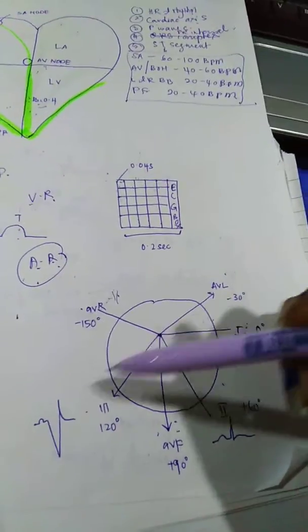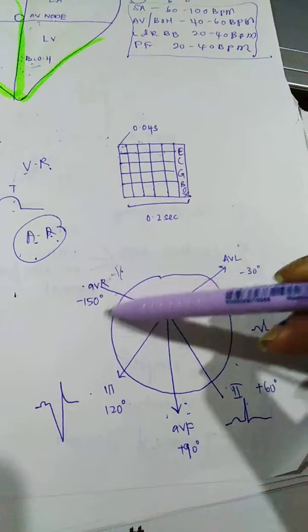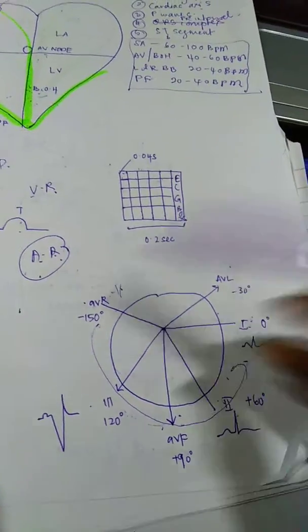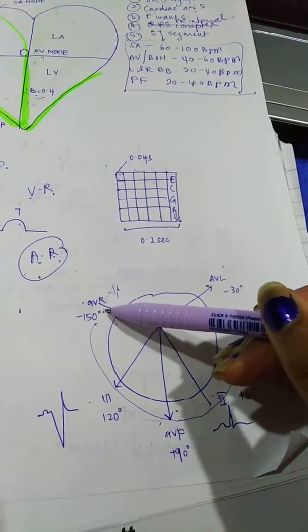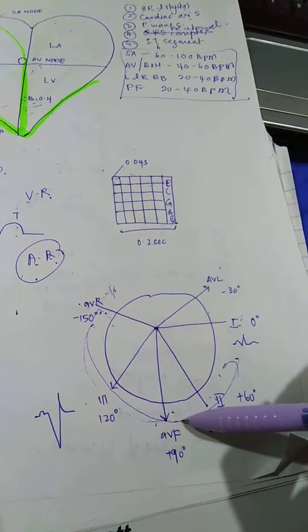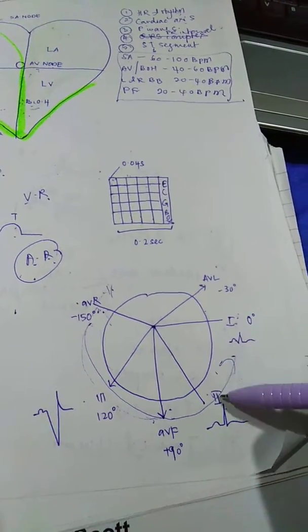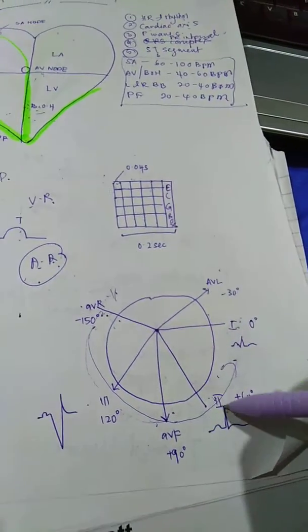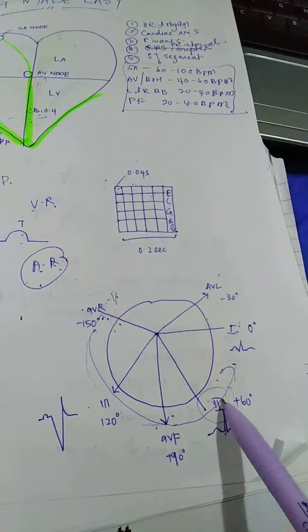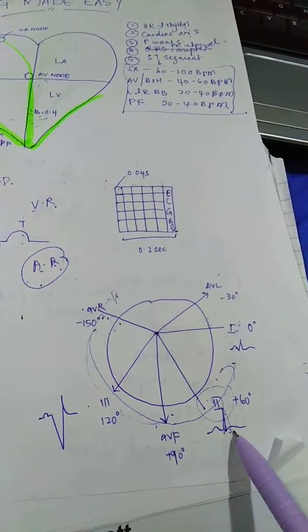So as I told you, a normal cardiac axis is from your 11 o'clock. It spreads this way. As you can see, since it starts from here and goes, the positive deflection is way stronger over 11 o'clock to 5 o'clock. That is where you see a positive upright QRS deflection over this area.